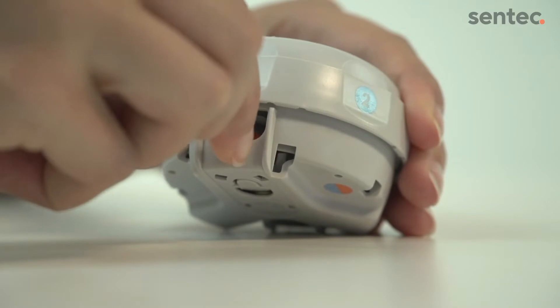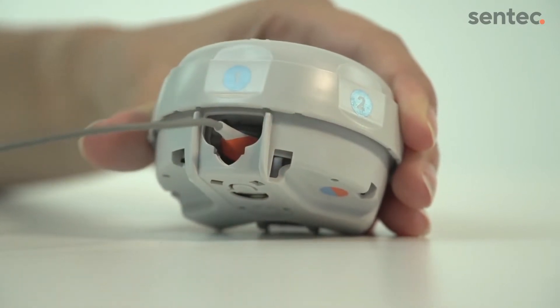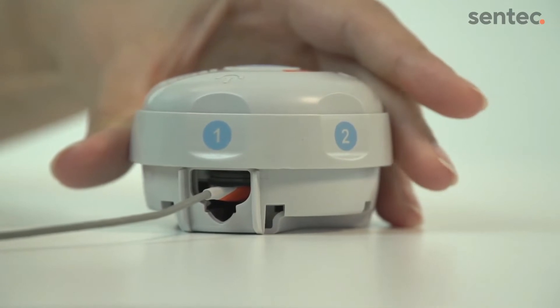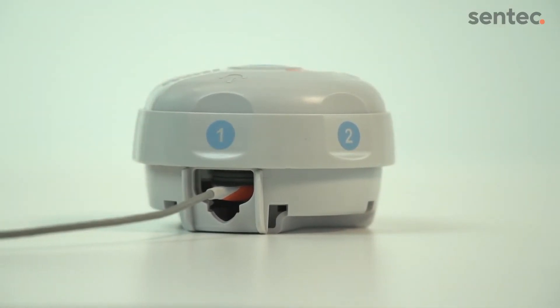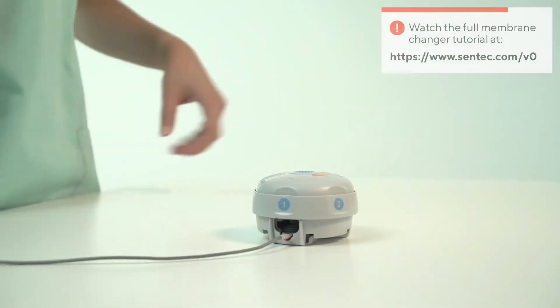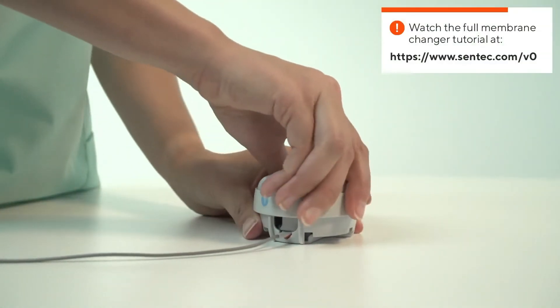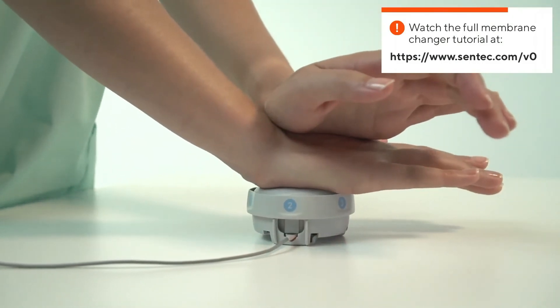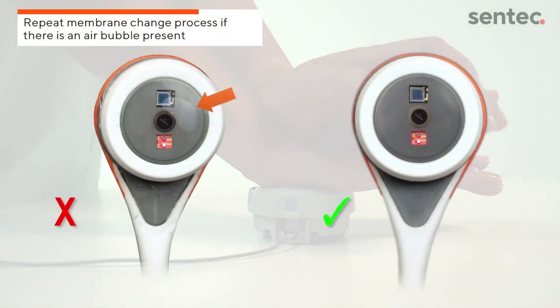Carefully insert the sensor into the membrane changer without touching the exposed sensor surface. Make sure the sensor is aligned correctly. Proceed with the membrane change as usual with the alternating pressing and turning steps. Make sure that there are no air bubbles and verify that the membrane is correctly seated on the sensor.